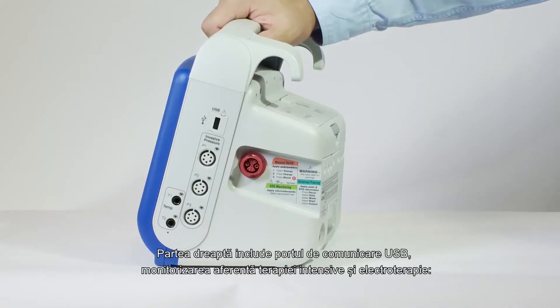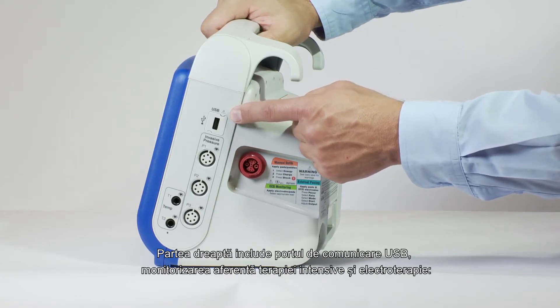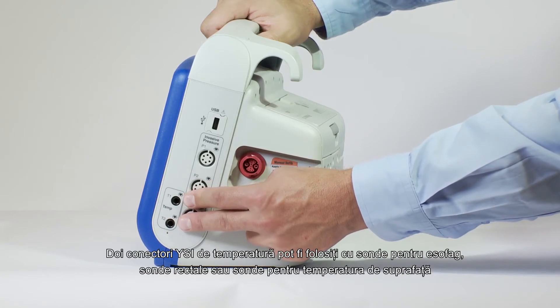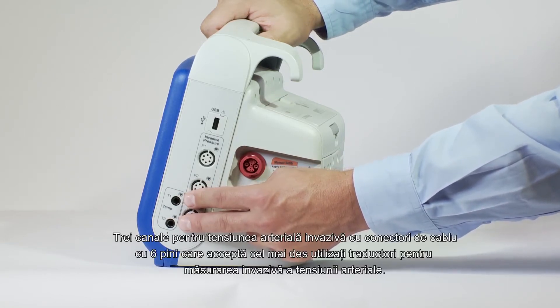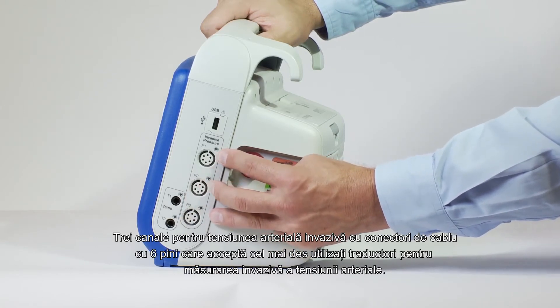The right side includes a USB communication port, critical care monitoring, and electrical therapies. Two temperature YSI connectors can be used with esophageal, rectal, or surface temperature monitor probes. Three invasive blood pressure channels with six-pin cable connectors accept the most commonly used transducers for invasive measurement of blood pressure.